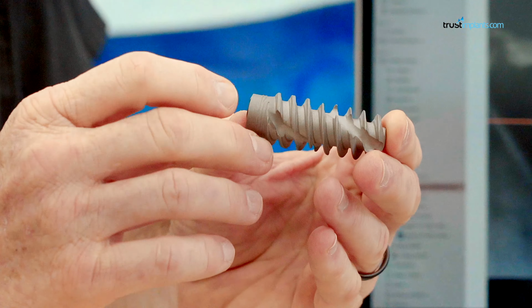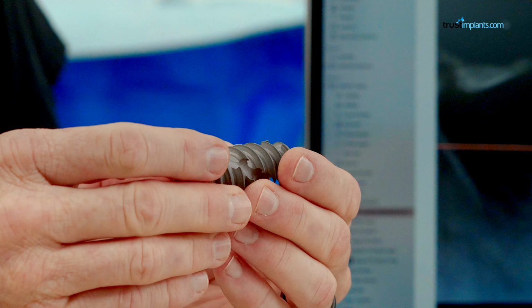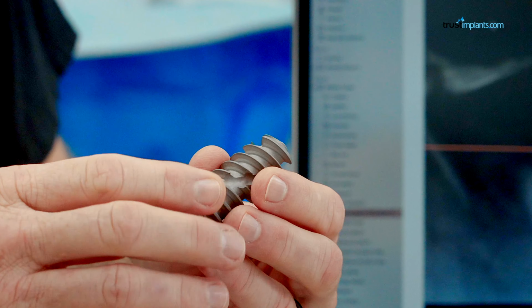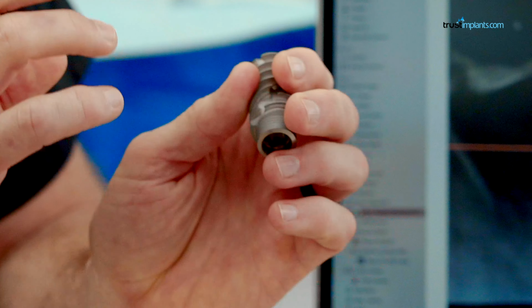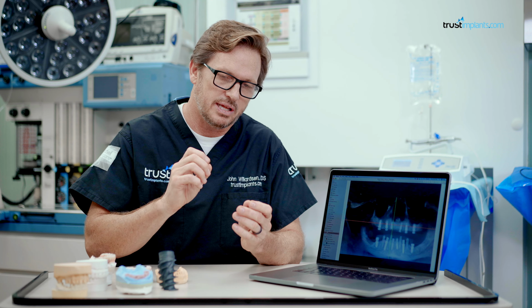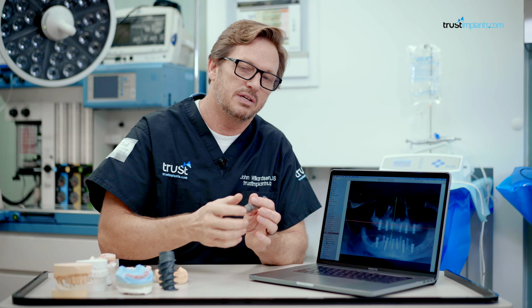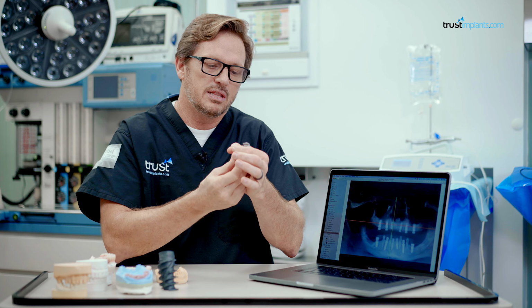And if you can see here, these threads are very aggressive, and it's considered what's called a bone screw. And so what I like about this implant is I can get a lot of fixation of the bone. I can engage that bone really well as the implant drives into the bone, and it actually pulls itself into the hole that I've made. The implant just pulls itself into what we call the osteotomy, or the hole.